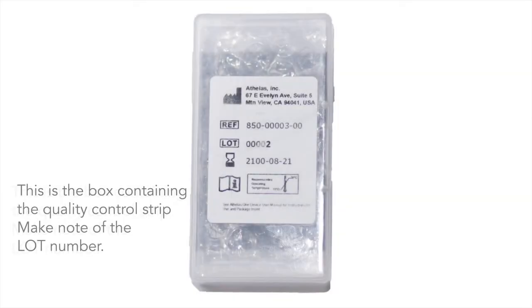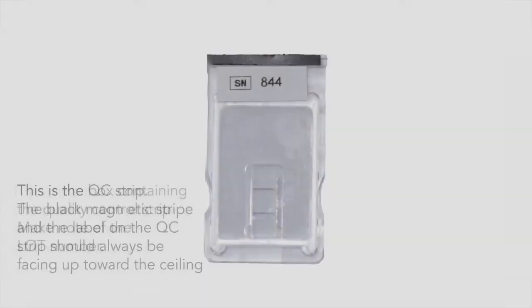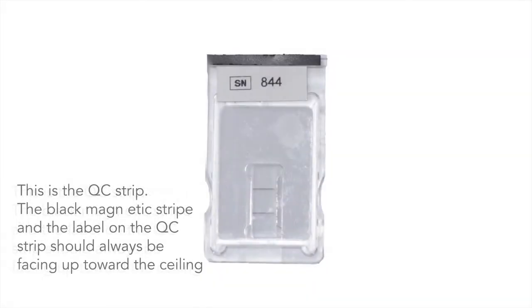This is the box containing your quality control strip. Make note of the lot number. This is the QC strip. The black magnetic stripe and the label on the QC strip should always be facing up towards the ceiling.